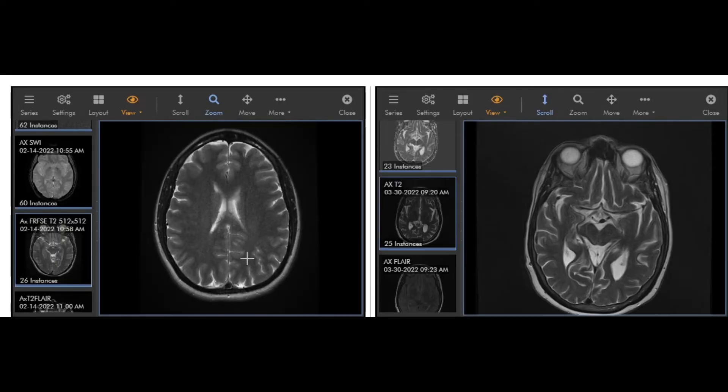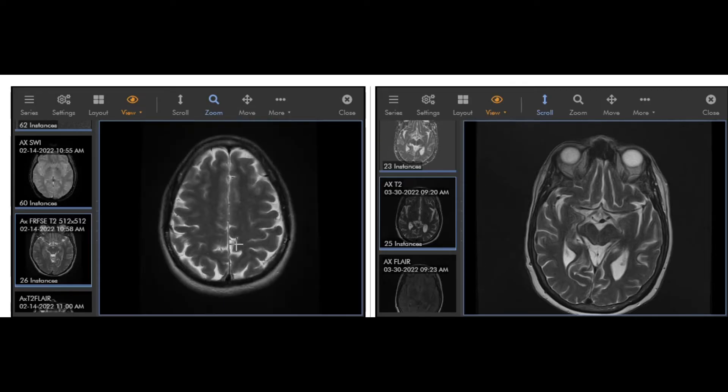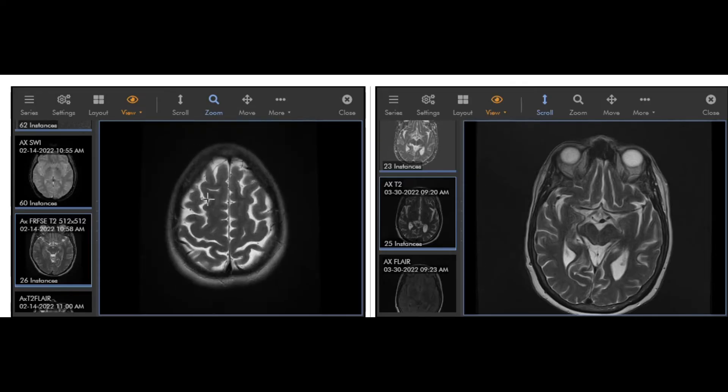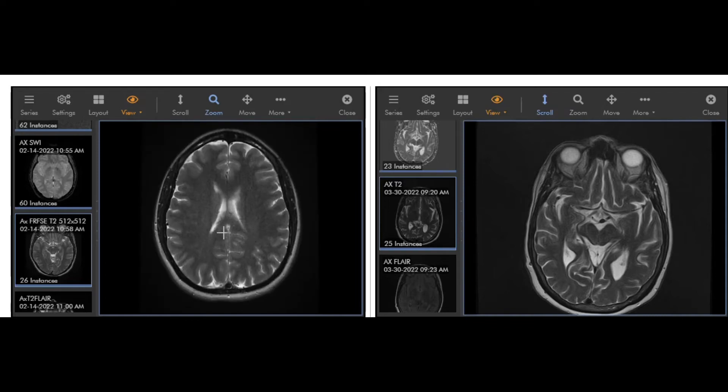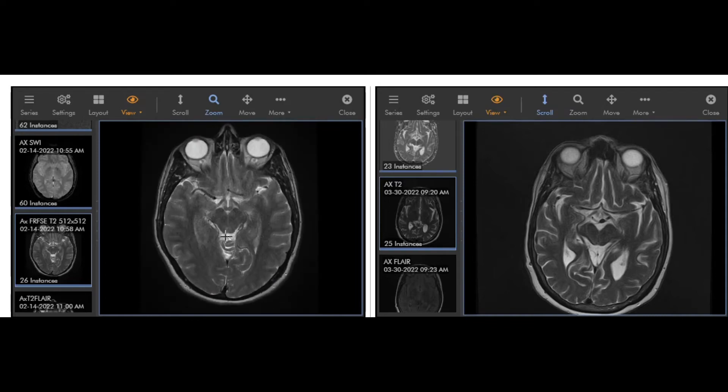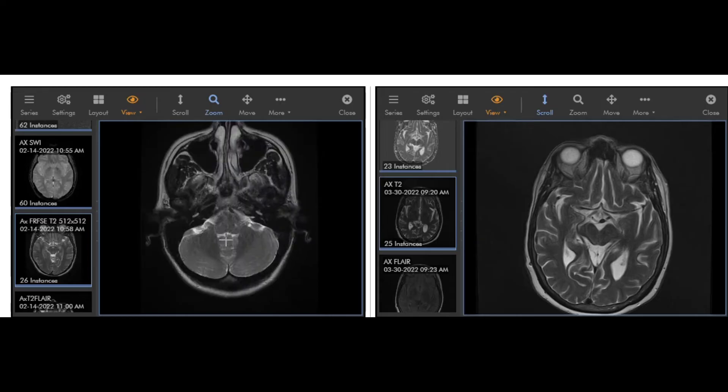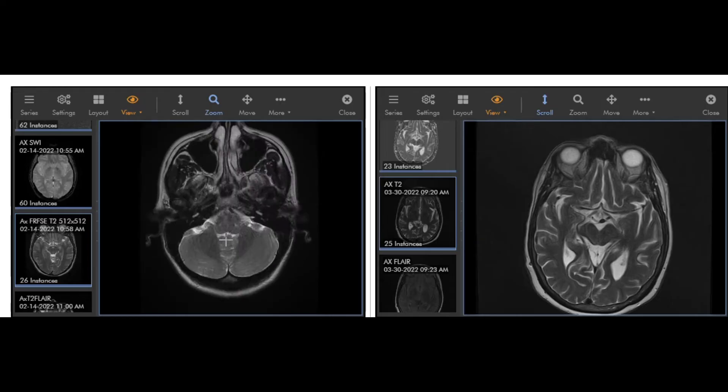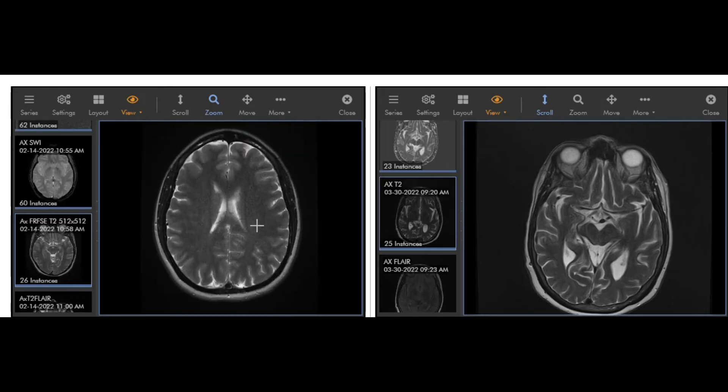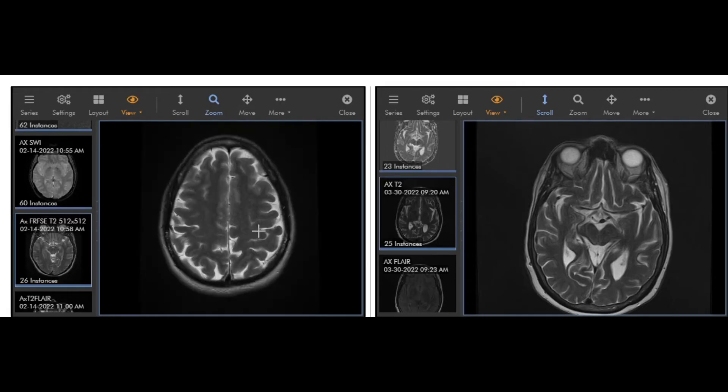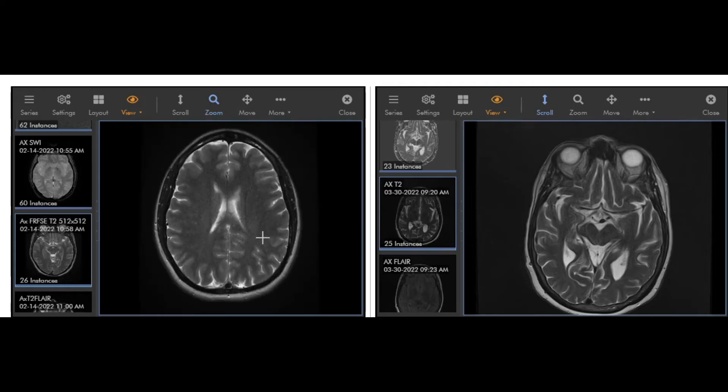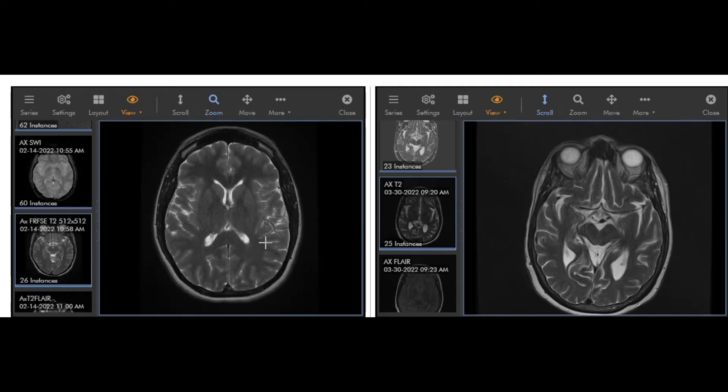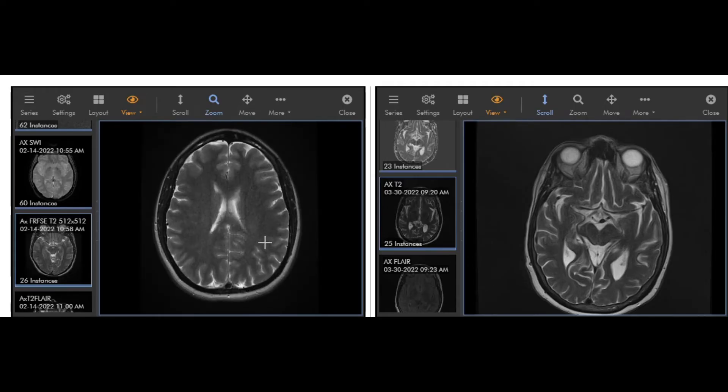The brain does look different on different types of MRI sequences, but this one is a T2 sequence that puts the fluid bright, and that allows us to see the brain very well on the white background. We do have another video on our page that shows you how to look at an MRI and does discuss this a little bit.